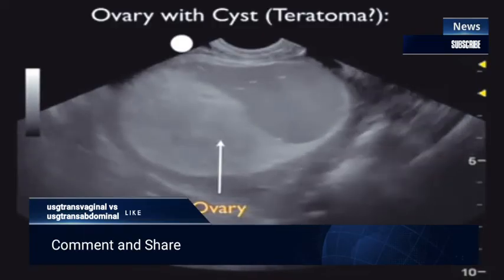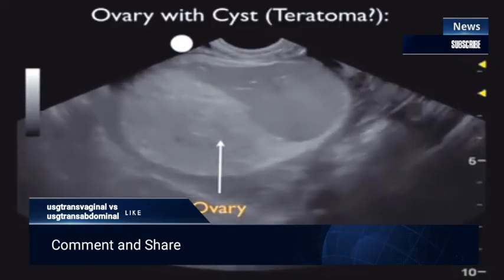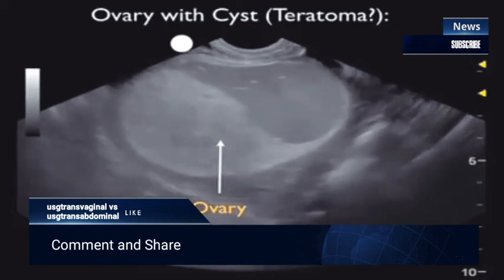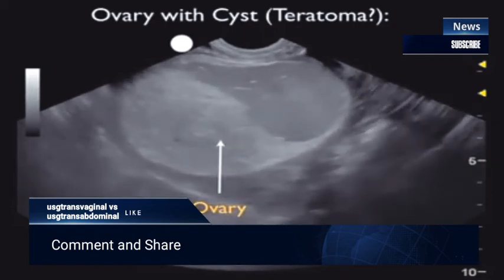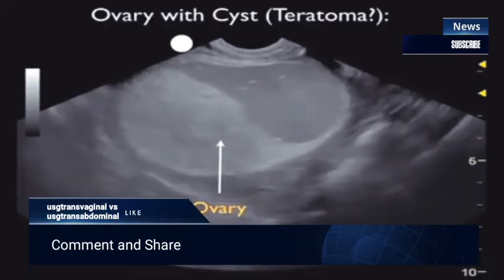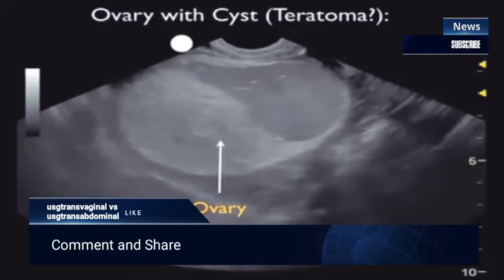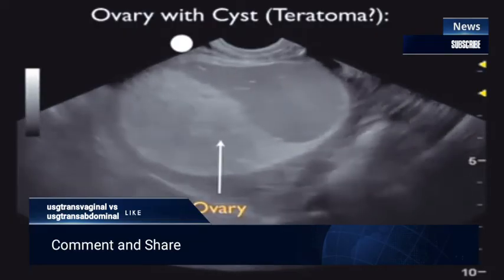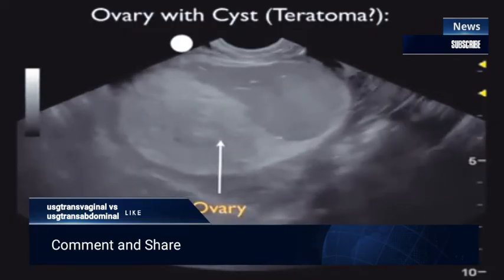And we recall that a teratoma is made up of many different types of fetal cell lines. We can actually have hair, teeth, and bone within the ovary. As we scan back and forth, we can actually see hyperechoic or bright areas consistent with probable teeth, the teeth of this ovary, if you will, but a probable teratoma on bedside sonography.